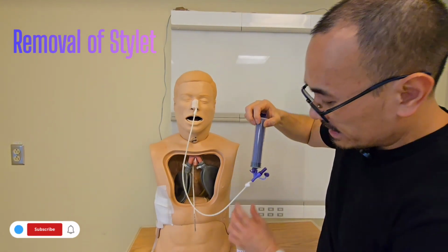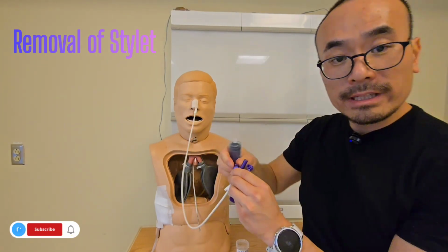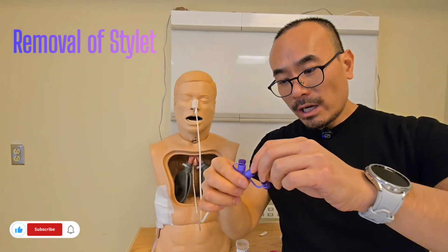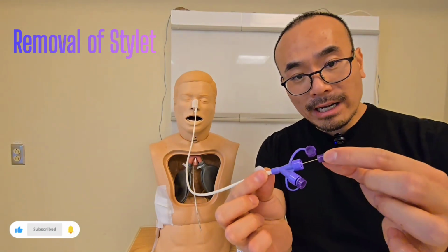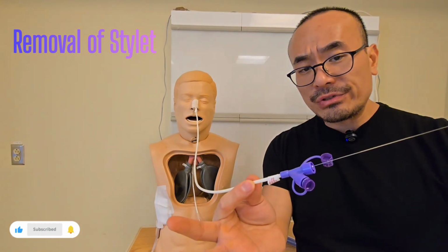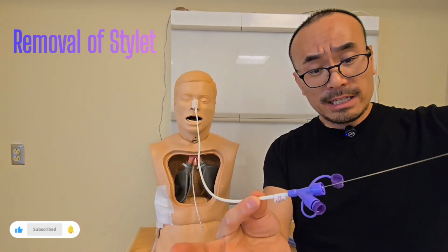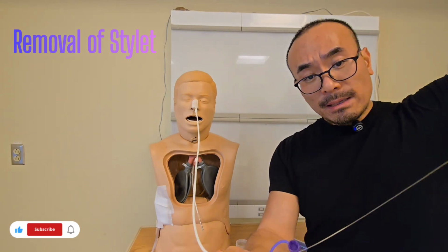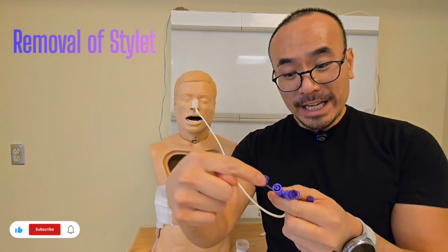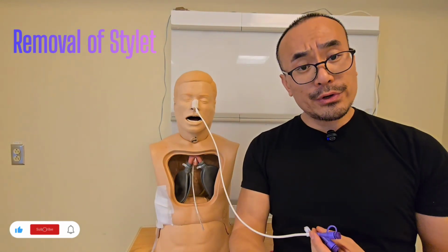Now that we have flushed it for the second time, this second flush is intended for the guide wire to come out. Once you have done that, watch how easily this metal guide wire should just come up. It should be no friction. It should just come out like butter, like a knife cutting through hot butter, okay? Just like that. Once the metal guide wire comes out, then you can connect your feed into here and you can start your feed as per your order.